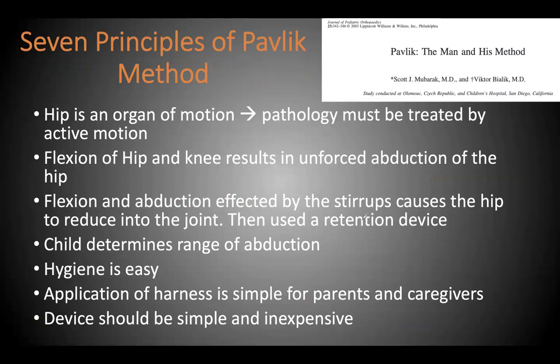This is called a Pavlik method rather than a Pavlik harness. What Dr. Arnold Pavlik said was that the hip joint is an organ of motion, and hence any pathology in the hip joint must be treated by active motion. So he designed this harness which keeps the hips in flexion and the knees in flexion. The position of flexion of the hips and the knees allows the hips to abduct just by the force of gravity. So here you are not trying to force abduction on the hips, but allowing the tightness of the adductors to gently ease out by gravity.